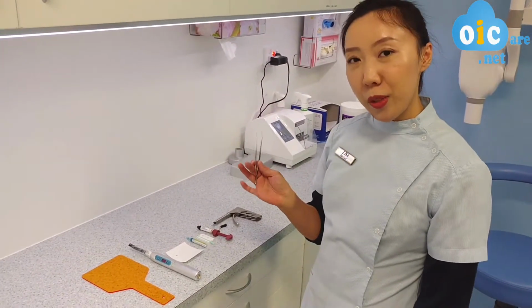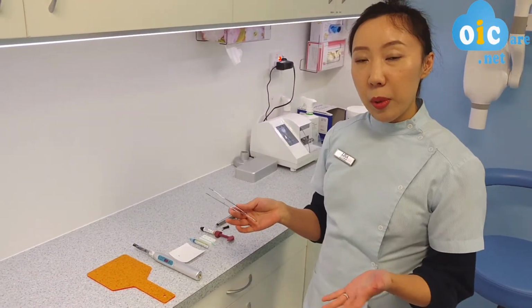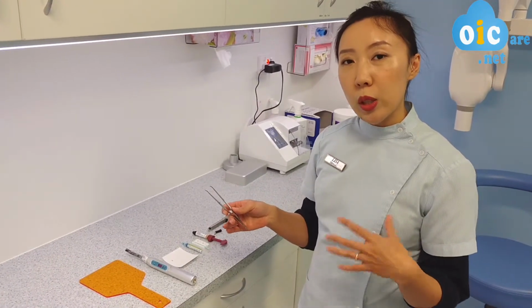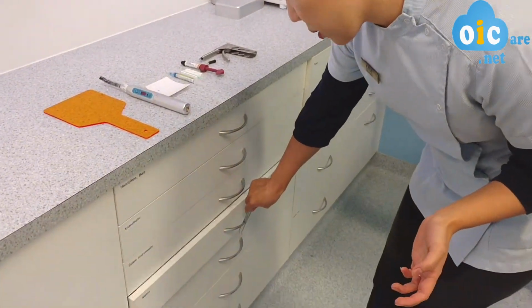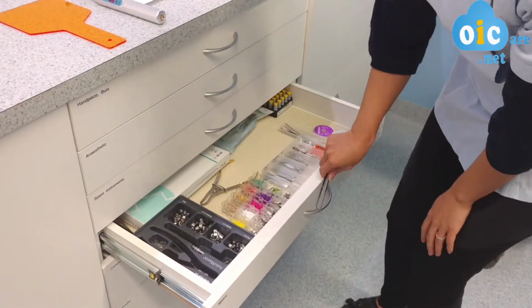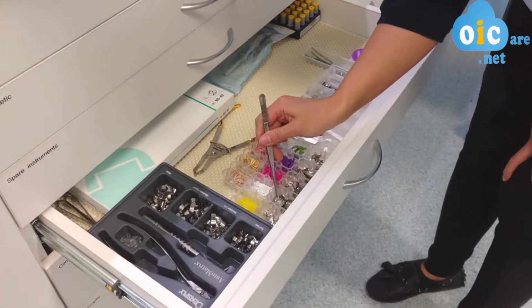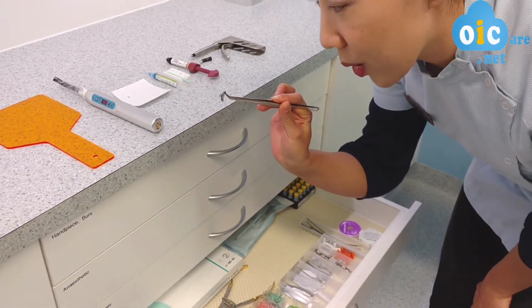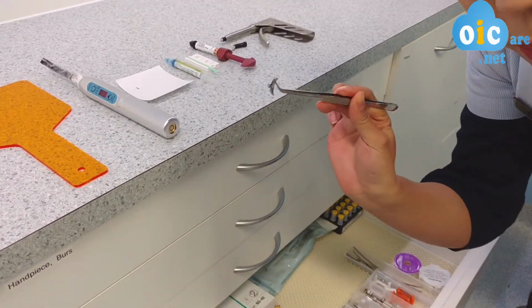After we have finished drilling your teeth and removed all the decay, we will start the filling process. If the cavity involves more than one surface, then we need to use something called matrices. Have a look here in this drawer, this is where we keep all our matrix bands. What matrix bands do is help to shape the filling. For example, if the cavity involves a surface in between the teeth, where teeth sit against each other, then we put a metal band like this in between your teeth.